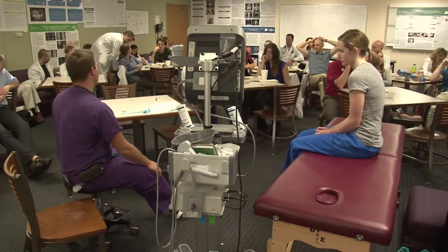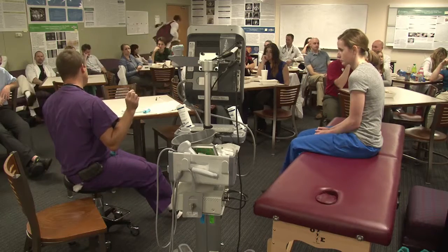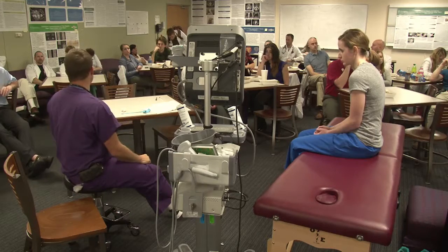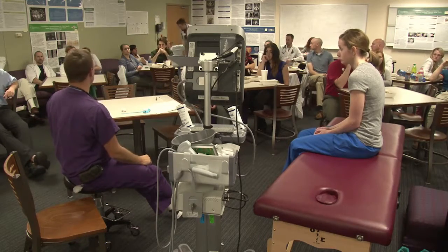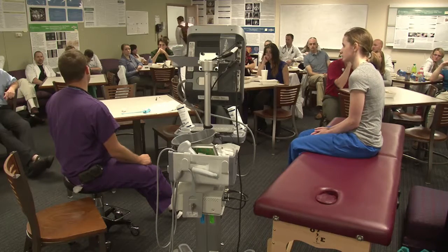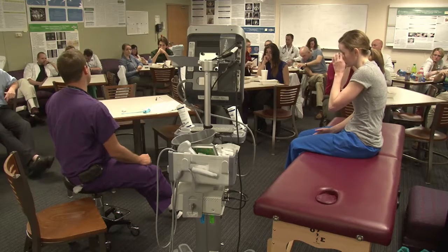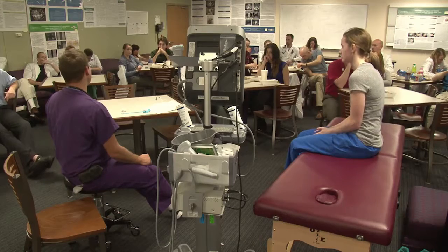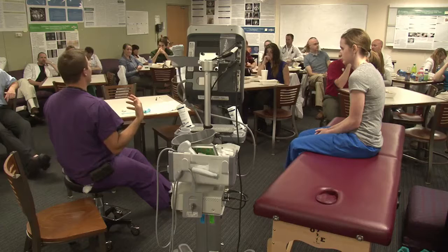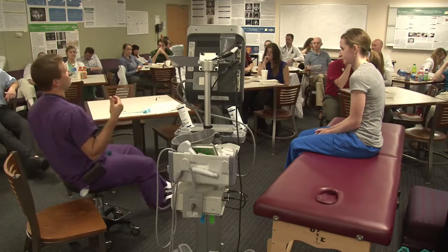The main problem that you're going to have with that is, like, no duh, you can't see the tip of the needle. So one way to kind of see the tip of the needle, because we're dealing with a really small needle, a really small vessel. It's so much easier to do a central line with ultrasound than it is to do a peripheral line, because the target is literally like 10 times bigger, okay? So the problem is you can't see the needle, and the vein is somewhat tortuous. It's not a straight shot like the central line is.